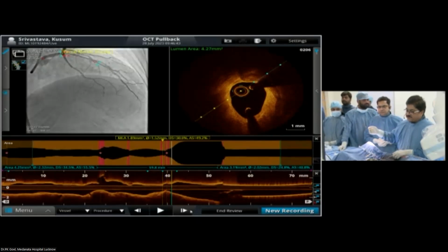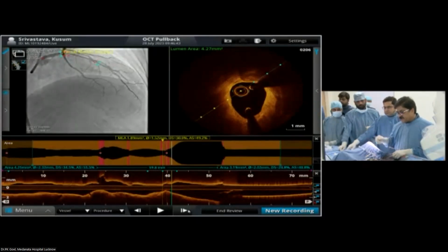Less than 2.5 for LAD is significant. So we have significant disease in the left main and LAD, and it is all calcific, and we have areas of 180 to 360 degrees calcium scattered all around. So my strategy, I wonder what would be the thoughts you would have.